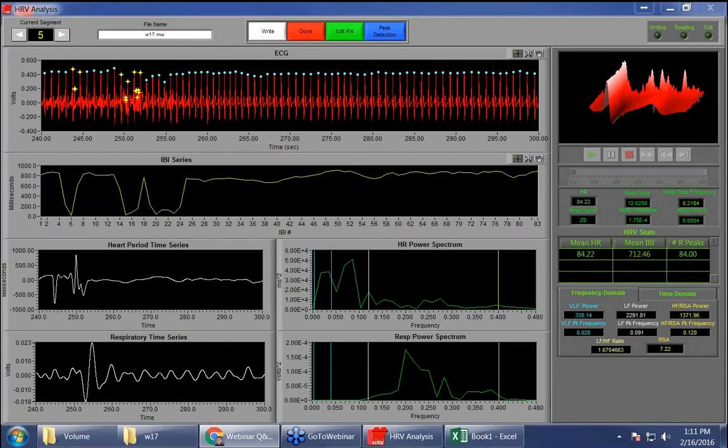We have another question here about how small can I make my segments in HRV? So 30 seconds is the shortest you could make them, just because to calculate that RSA, you're going to need a minimum of 30 seconds. And then again, if you did decide to do anything within there and you had a section which you had to delete, then you automatically wouldn't be able to use that segment because there would be some time in which you would have to delete it. So that wouldn't be valid for RSA.